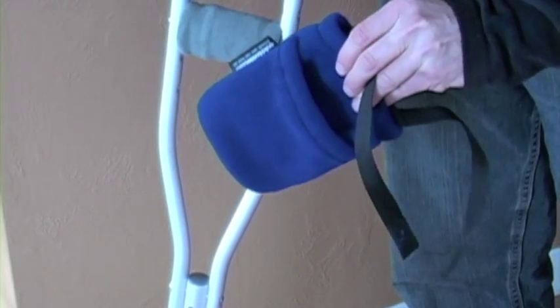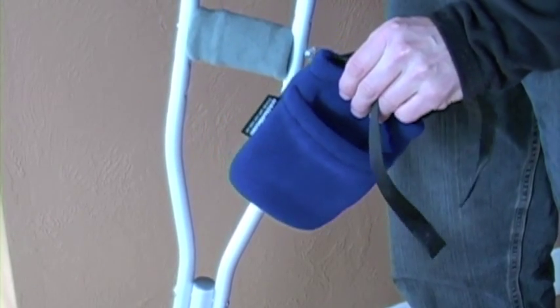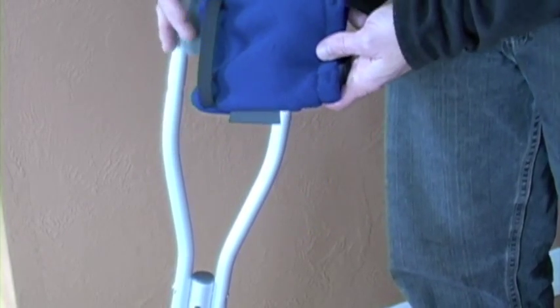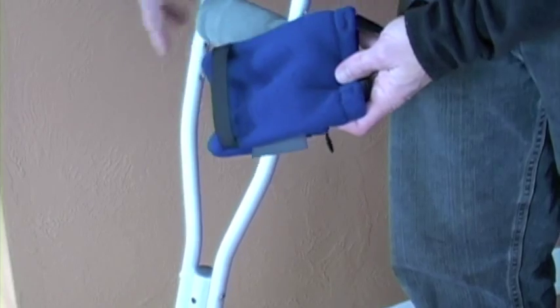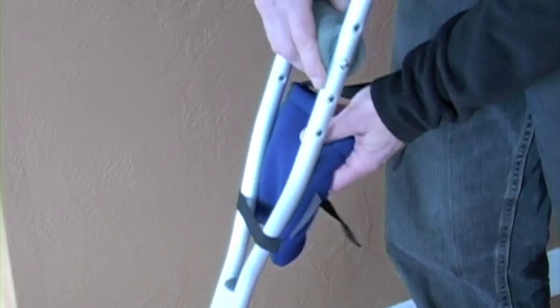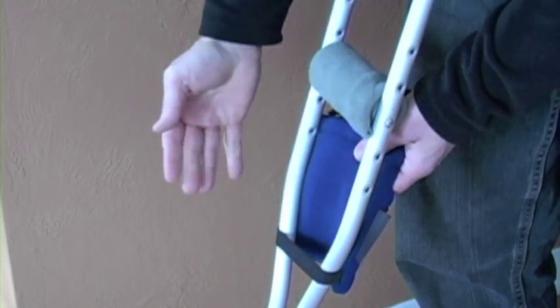I'm going to show you real quickly how to install your crutch pocket onto your crutches. It goes real fast. We're just going to look on the back of the pocket — there's some elastic here — and we're just going to slide the crutch right down through the elastic there. And that's going to hold it in place.